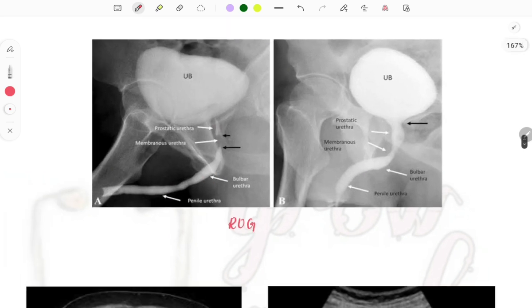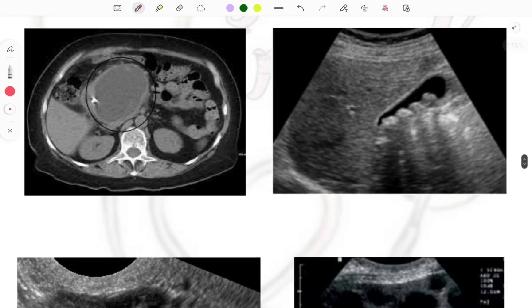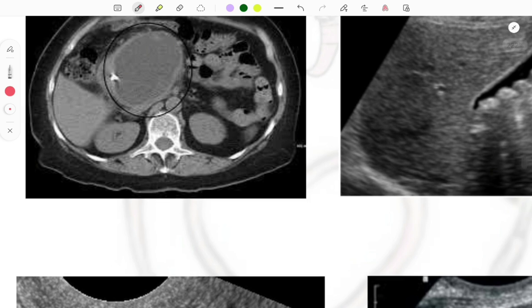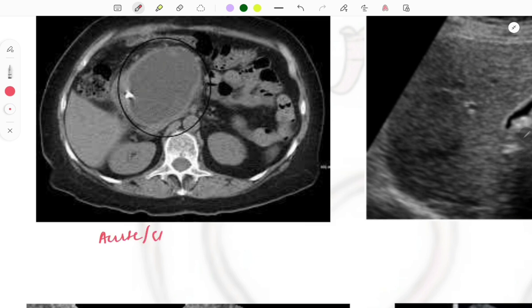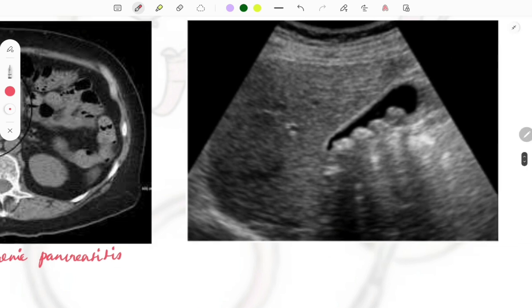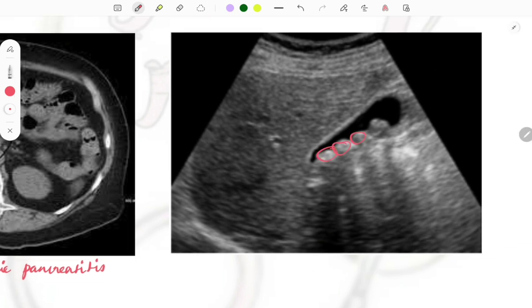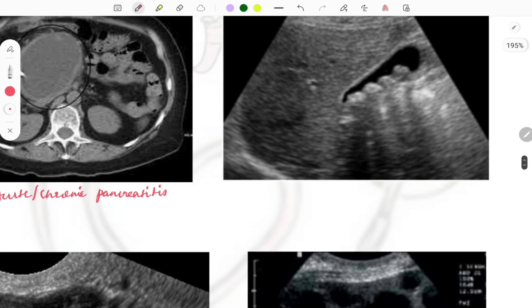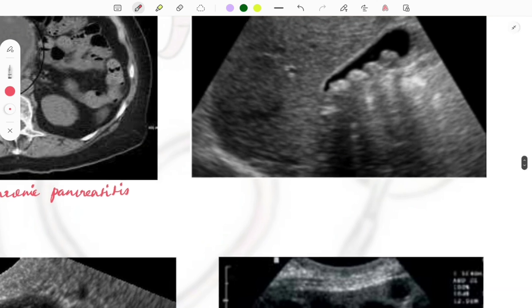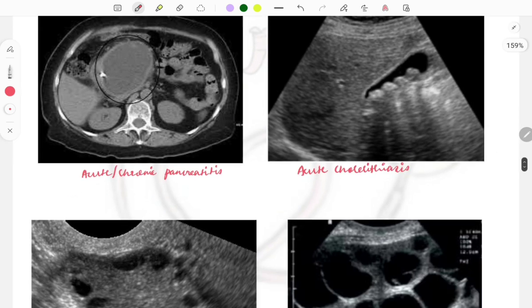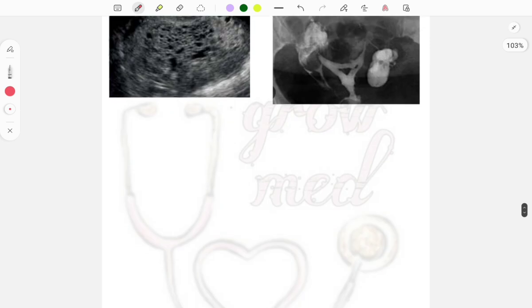The next image is of pancreatic pseudocyst — a complication associated with both acute and chronic pancreatitis. Following that, this image shows multiple stones in the gallbladder with their acoustic shadows — this is acute cholelithiasis. It is most commonly seen in females, with clinical presentation of right-sided abdominal pain.